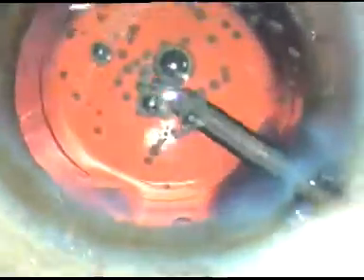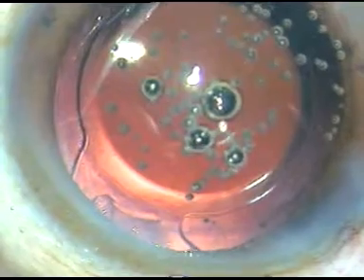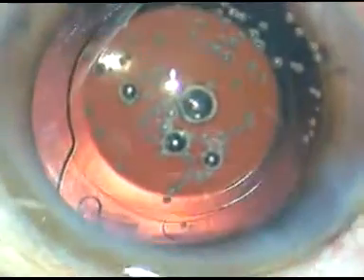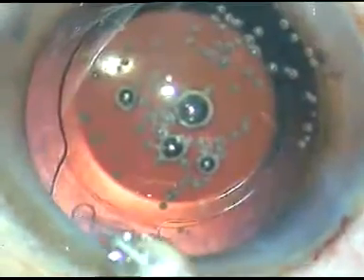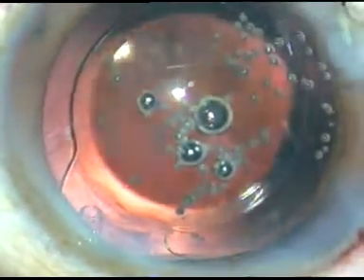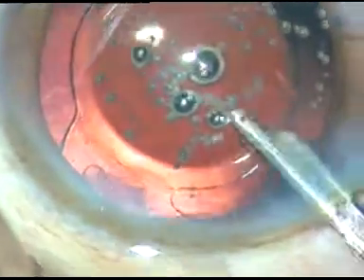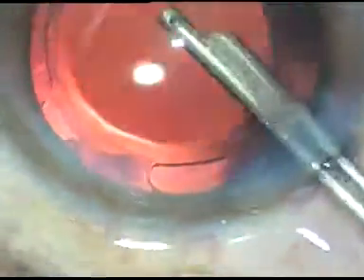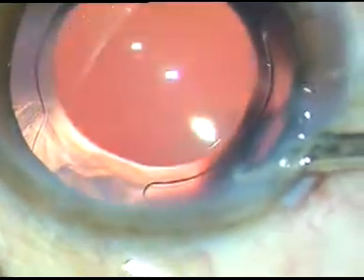Now you can see there are a lot of air bubbles sticking to the posterior capsule. Actually, there is HPMC — hydroxypropyl methylcellulose — also sticking to the corneal endothelium. So, after hydrating these side ports, I am going to take the Simcoe cannula. I have taken some BSS in the syringe, and I am flushing it gently towards the corneal endothelium, removing the viscoelastic sticking there. The corneal endothelium is cleaned out, and all the air bubbles came out. The case is looking very clean. The anterior chamber is formed and the case is concluded. Thank you very much for your attention.